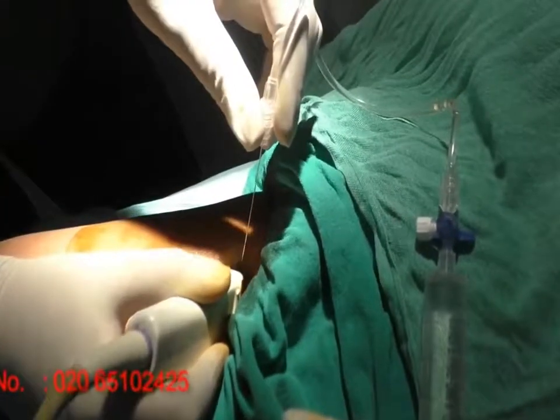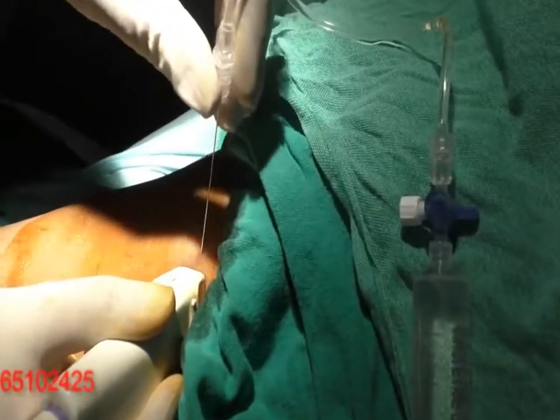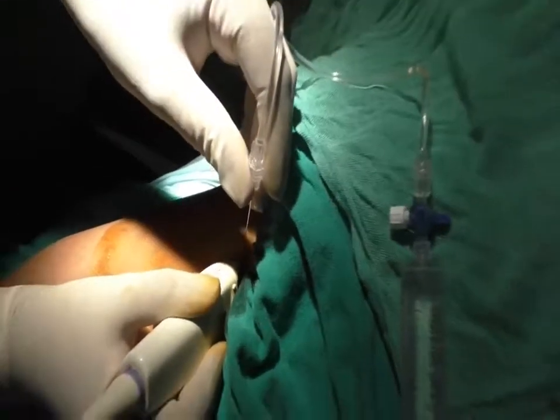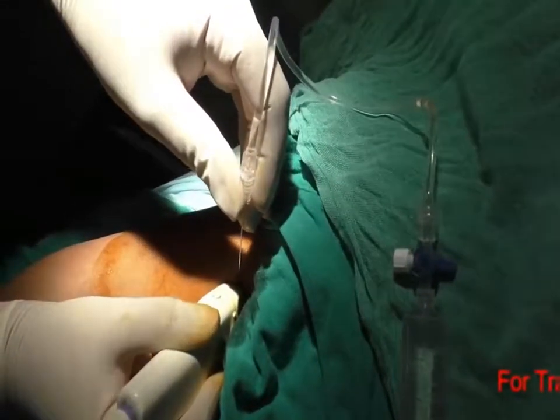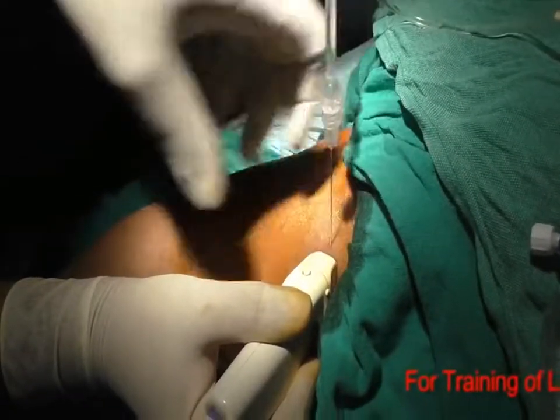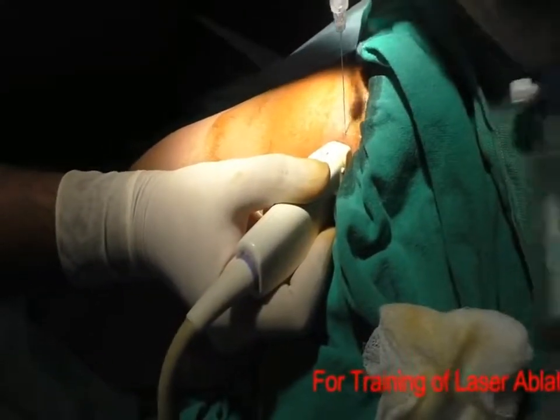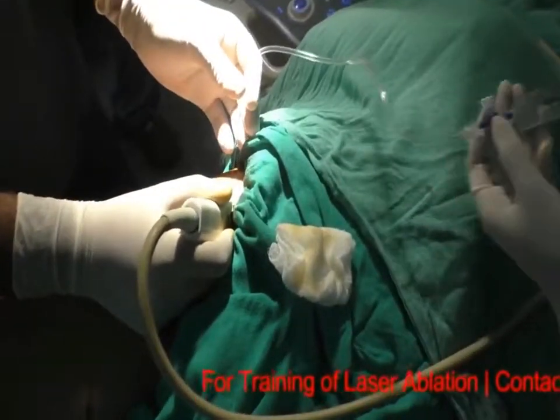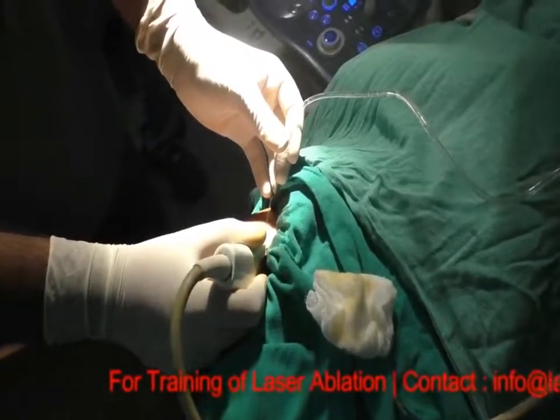You can see the trajectory of the needle going inside. It has to pierce fascia lata first and then go to fascia iliaca. What we use here is lignocaine with a bit of soda bicarb for quick action. Just a minute — aspirate. Now you can see on screen — aspirate.